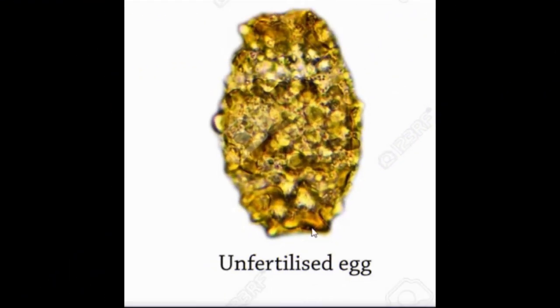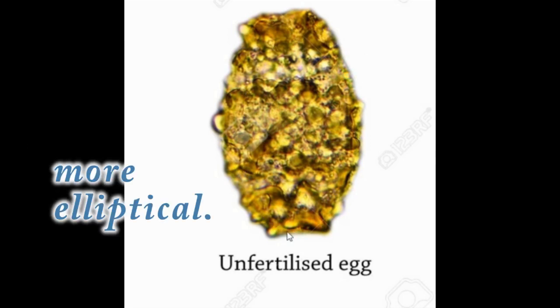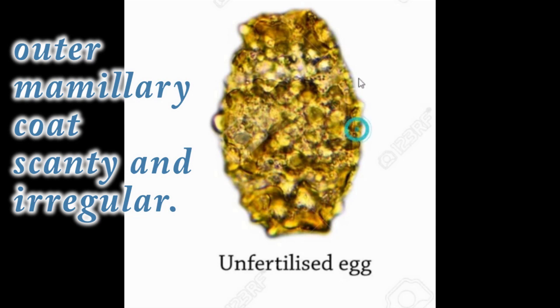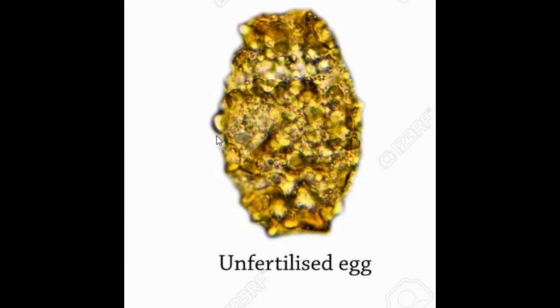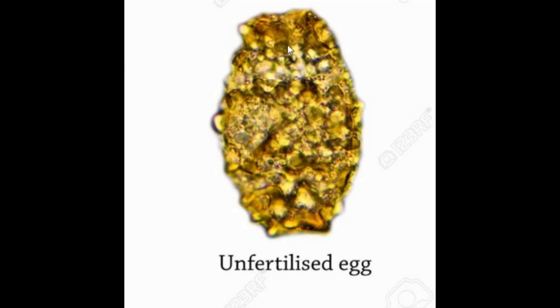This is the unfertilized Ascaris egg. The unfertilized egg is longer — up to 90 micrometers — and more elliptical in shape. The shell is thinner, with an outer mammillary coat that is scanty and irregular. The interior is atrophic and contains numerous disorganized, highly refractile granules, which you can see clearly in the unfertilized Ascaris egg.